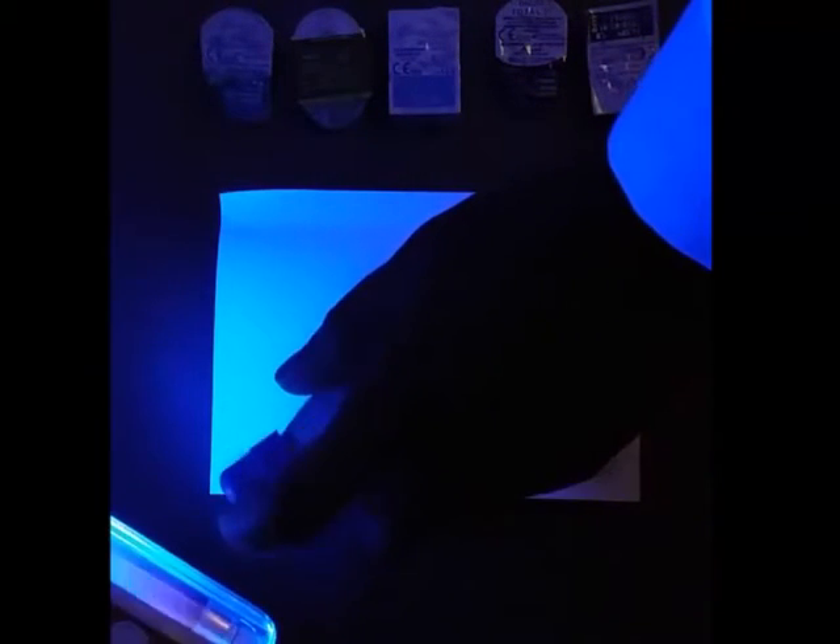I'm just going to spray just the corner here. You can see how the UV reflection is actually diminished in that area — it doesn't reflect because the UV sunscreen has blocked the UV from reflecting in that area. I'm going to put this down and turn it off.